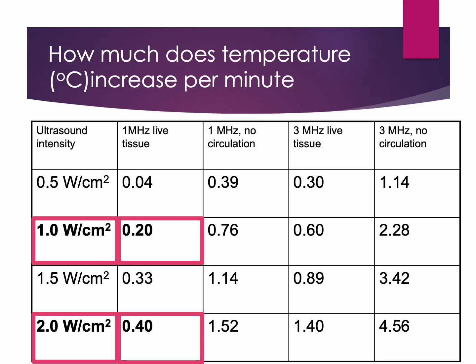We can also alter the intensity to change the treatment time. You can see here that if you double the intensity, keeping the frequency the same, the tissue heats up twice as fast.